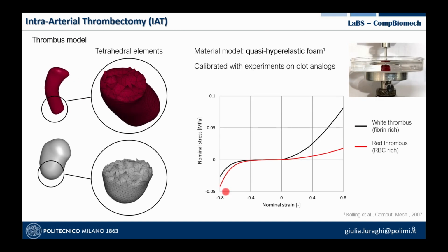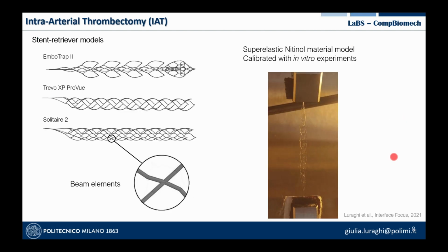Clots are discretized with tetrahedral elements, and we perform some unconfined compression tests and tensile tests to mechanically evaluate the thrombus material. And you can see very different behavior for the different clot compositions. As for the stent retriever, we reconstruct the geometry, and then we discretize it with beam elements. To calibrate the material to model the nitinol, we perform a tensile test, as you can see from the video.